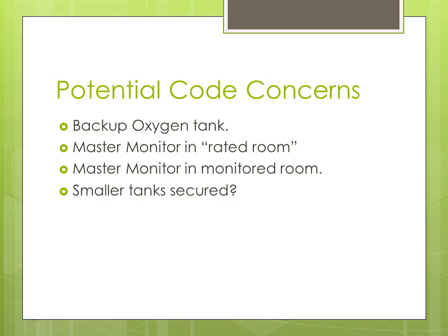We didn't see a backup oxygen tank. Okay, there should have been a little tank there. The master monitor, I had put a question: I wonder if it's in a rated room, and we'll talk about that in a minute. And is the master monitor in a monitored room? And then also, are the smaller tanks secured? So let's go back and look at this again and look at those things.